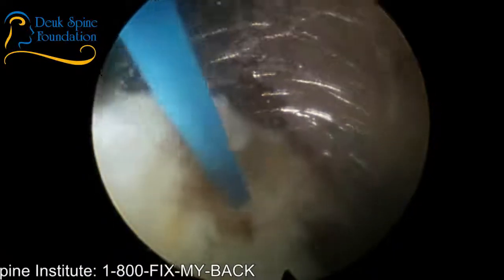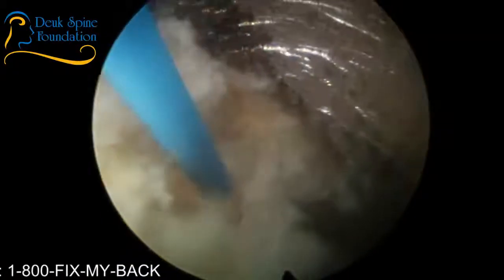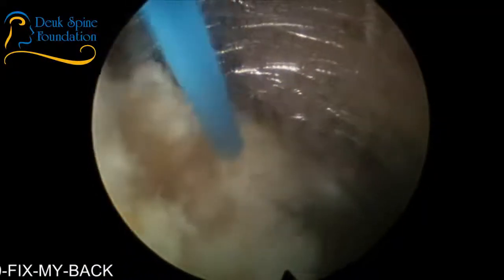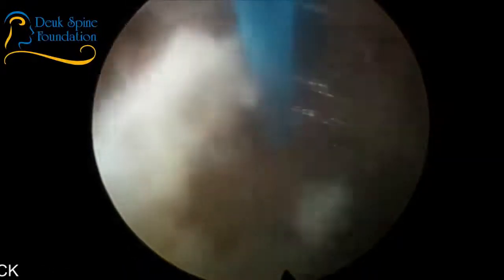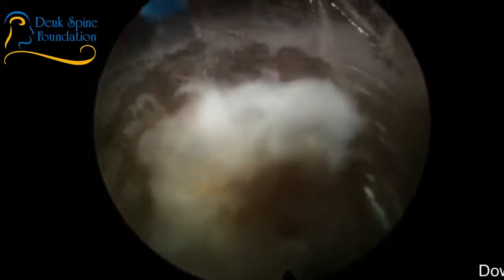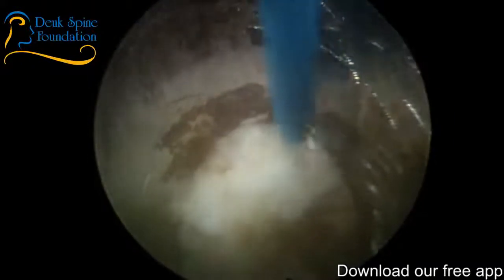So she inherited my father's ability to learn languages. I didn't. I can't move this wire. You're holding it and keeping it from twisting. Can't do that. All right, we'll be done in 10 minutes max. We actually got lucky. We're able to get into this disc.